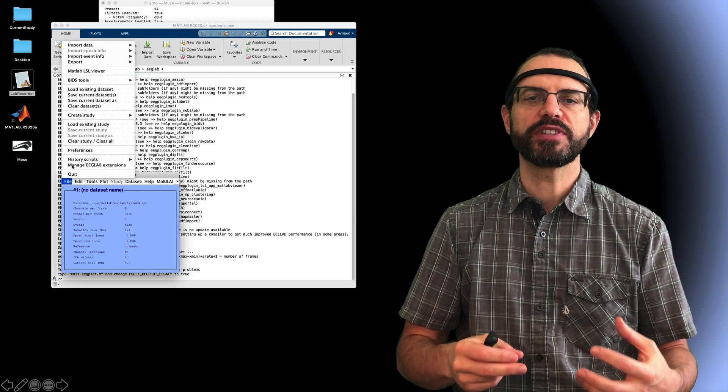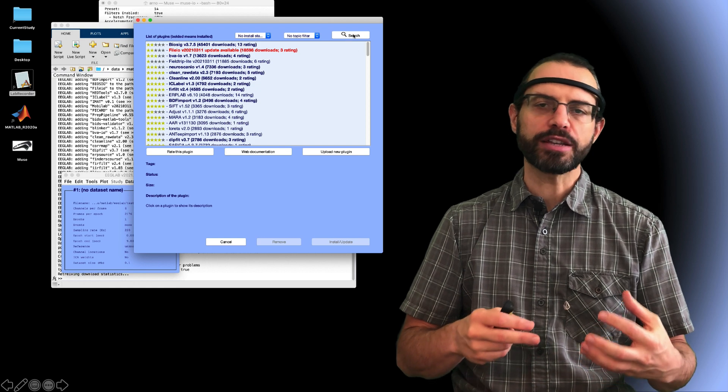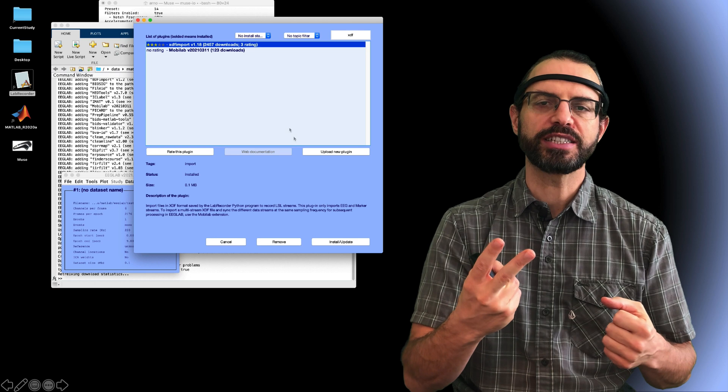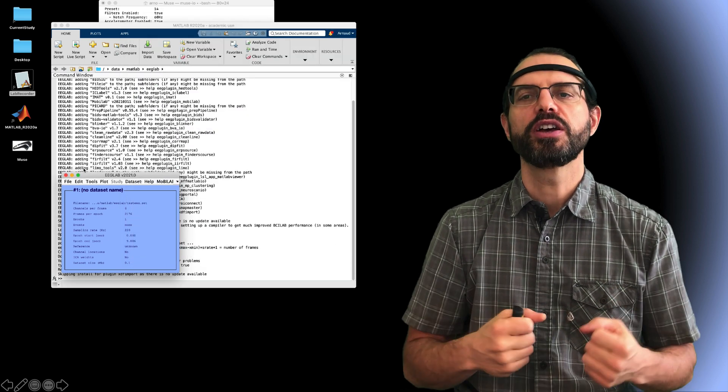So, what do we do with this file? Well, we go back to EEGLAB and we can install the XDF importer. There's two ways to import XDF files. I will show you both here. First, we'll use the XDF plugin.